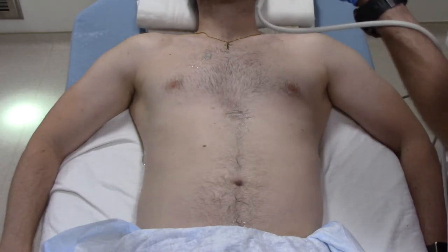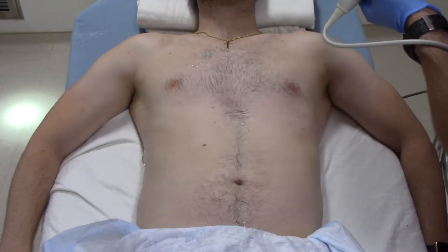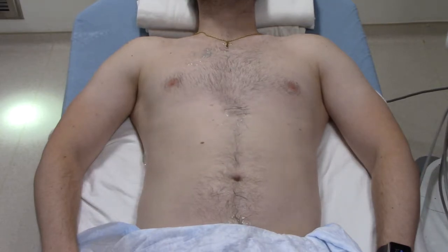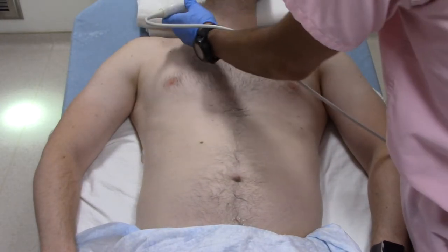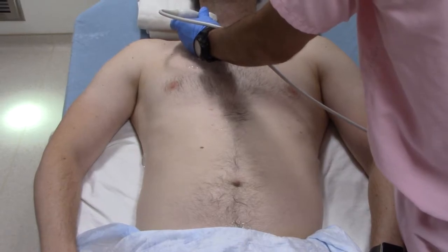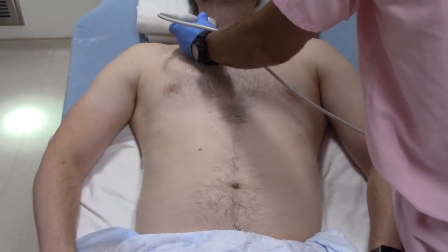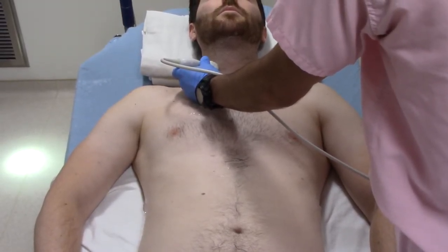When we switch over to IJs, we're going to keep our linear high-frequency transducer but change our presets. We want to start on the right side in cross-section, so our indicator is pointed towards the patient's right at about the level of the cricoid. Keep in mind that we need to hold C-spine if the patient is in a collar — just take the anterior piece of the collar off. Rest your hand on the patient's clavicle, giving yourself a nice bit of gel so as not to compress the IJ, because we're really looking at the collapsibility of the IJ for fluid responsiveness.